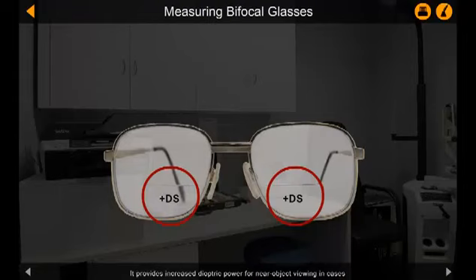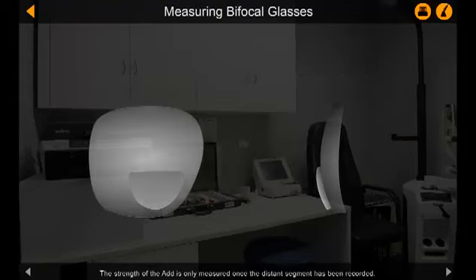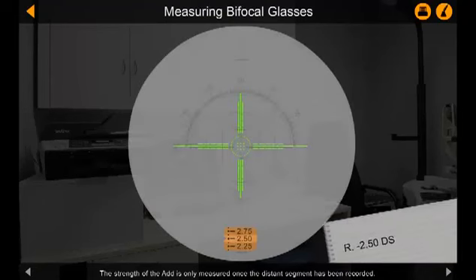The location of the add is placed in this lower part of the lens, as we generally look down when we read, and therefore through that part of the lens. Let's first look at measuring adds on spherical lenses. The strength of the add is only measured once the distance segment has been recorded.